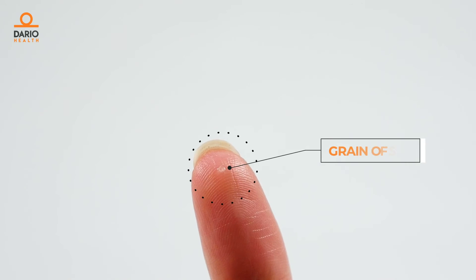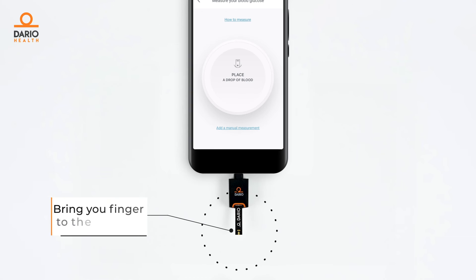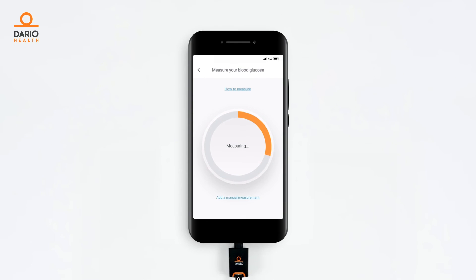Dario only requires a drop of blood the size of a grain of sugar. Bring your finger like this to the test strip. As you can see, the test strip draws the blood for measuring.